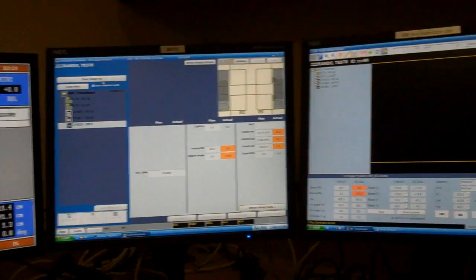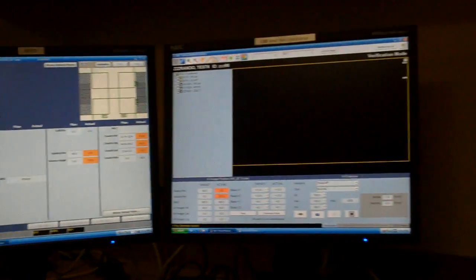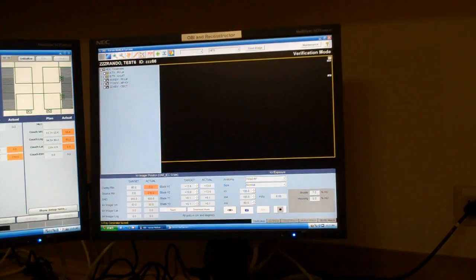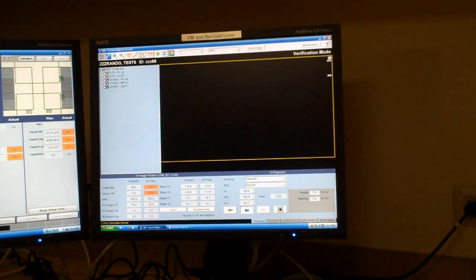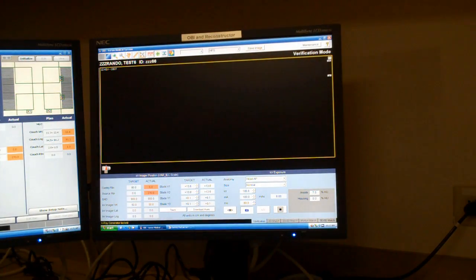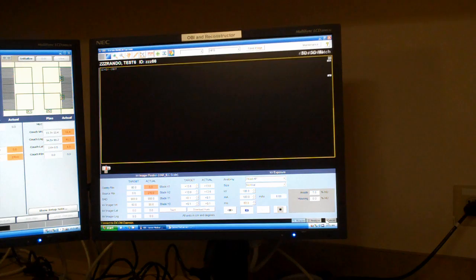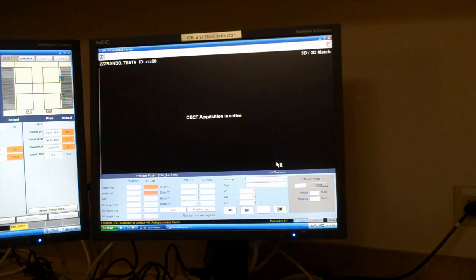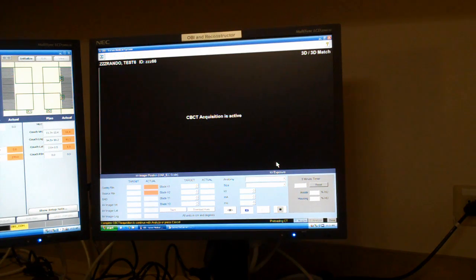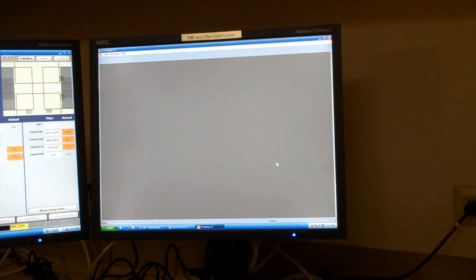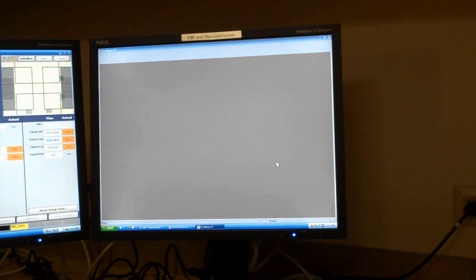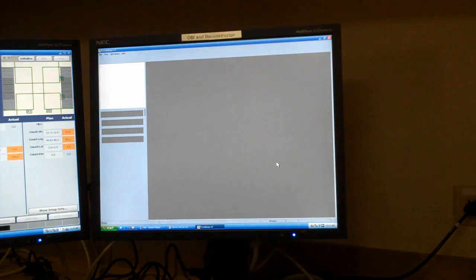What this does is it sends information over to the OBI workstation where I click 3D 3D Match. And this is going to close the OBI program and open up Cone Beam CT, which is a separate program.